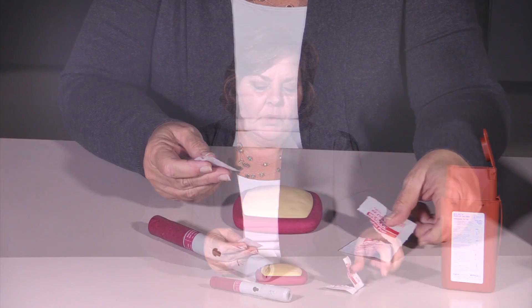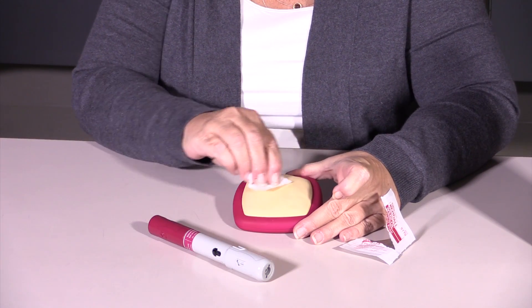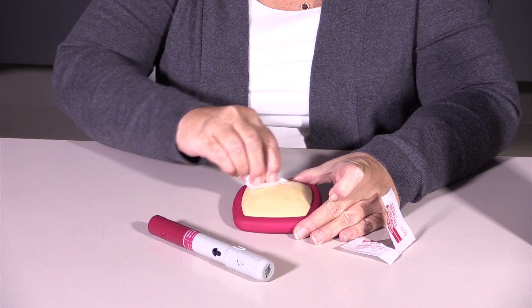So the first thing we're going to do is prepare our skin. We'll take our alcohol wipe and go in a circular motion for about 30 seconds, and once you've got that nice and cleaned off, you're going to let that dry.